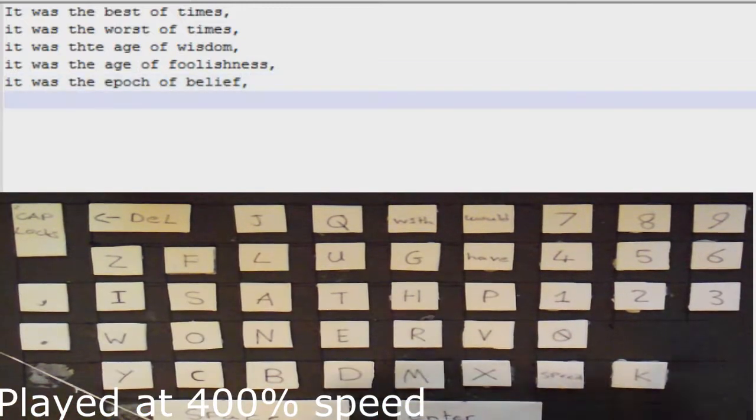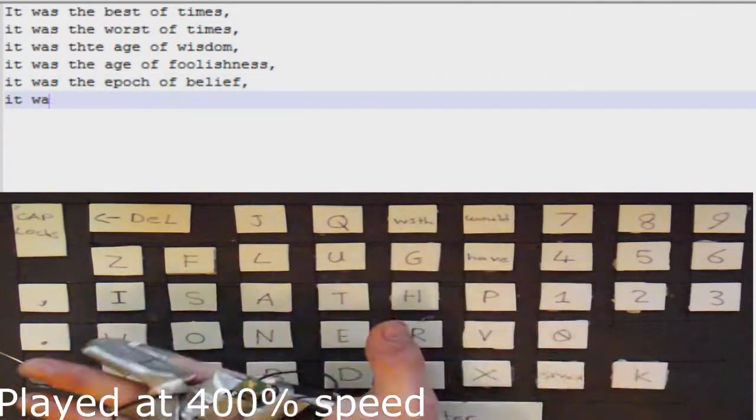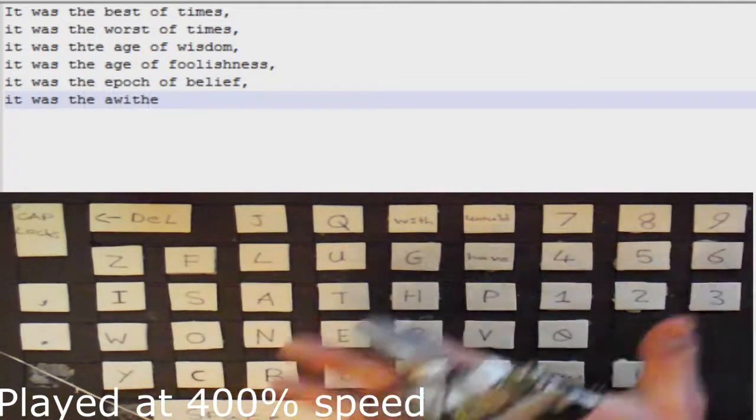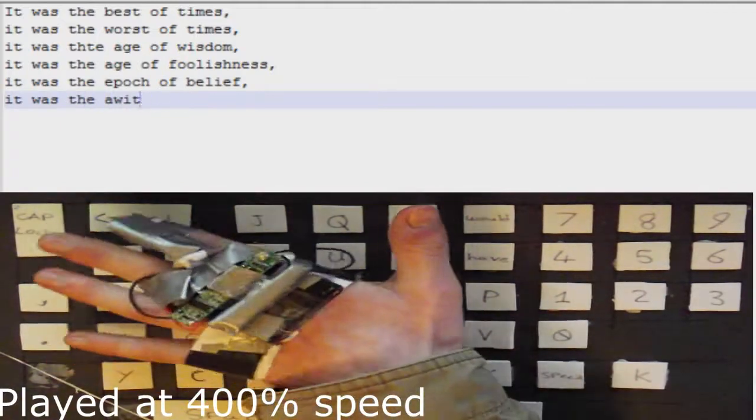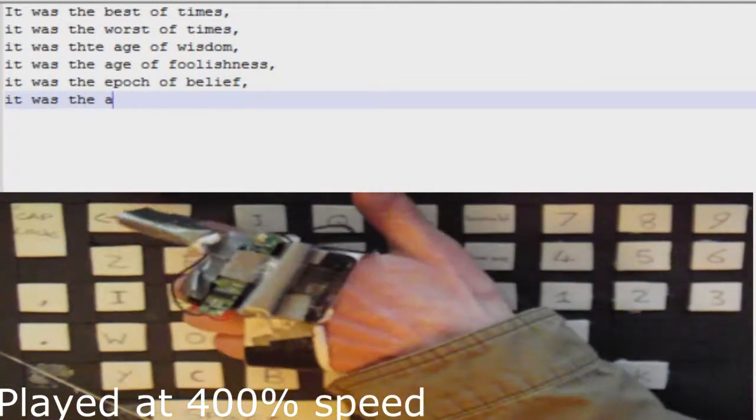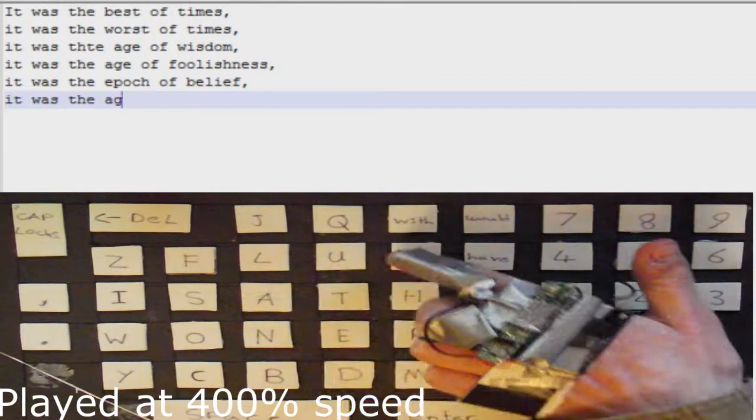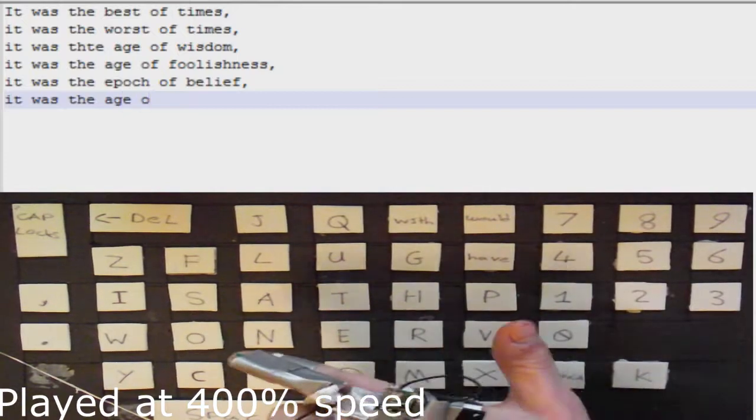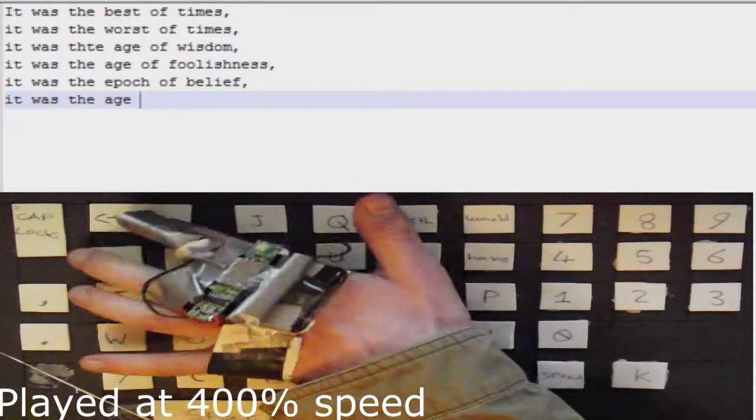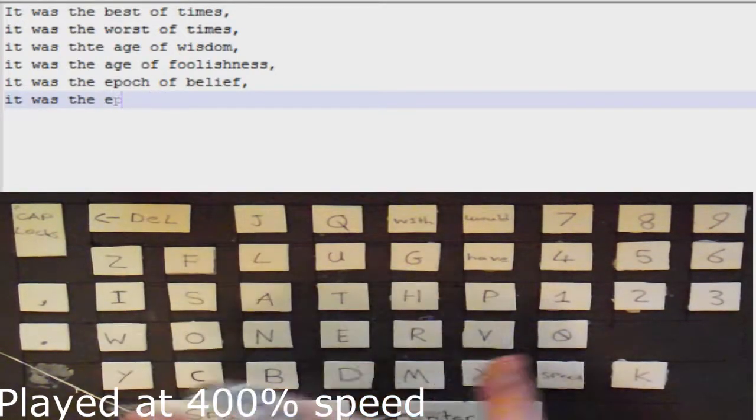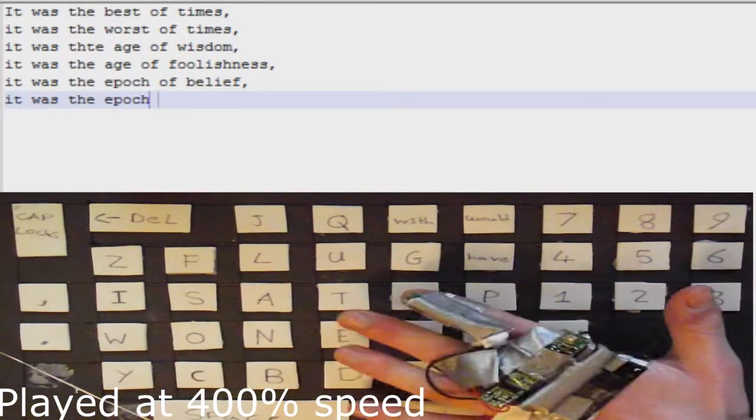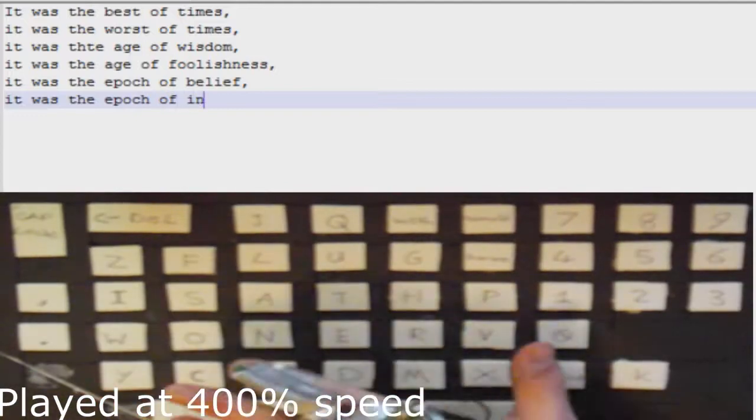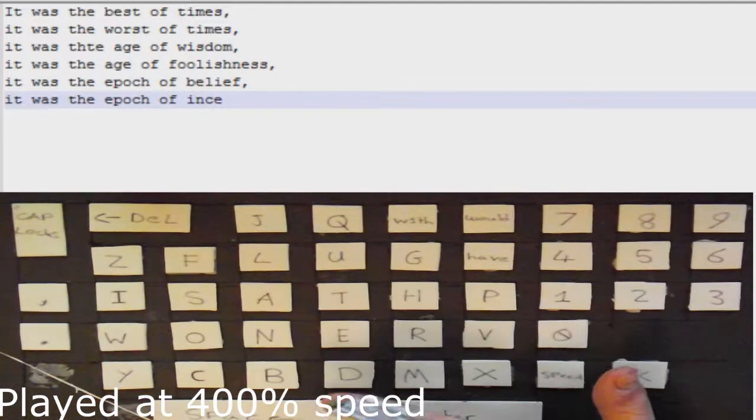However, this device, rather than $650, cost me less than $100 to build. The price of two Wii remotes and two wireless sensor bars. You could easily get the price of each system down to below $40 with mass production. And it will work with every kind of disability that requires a custom interface.